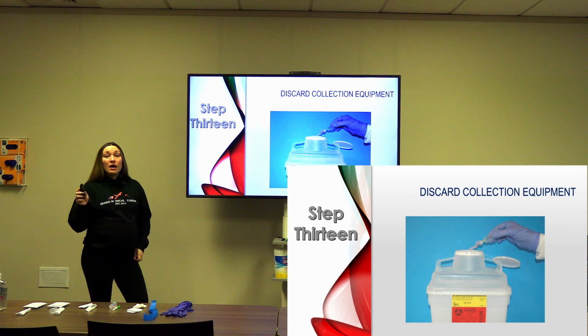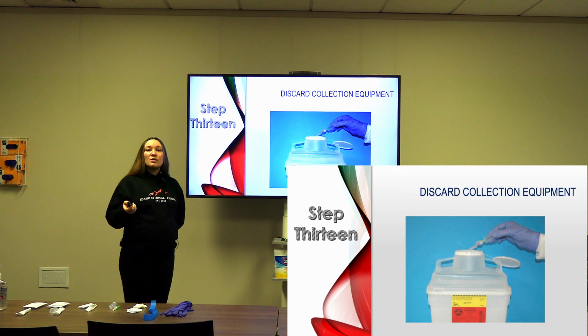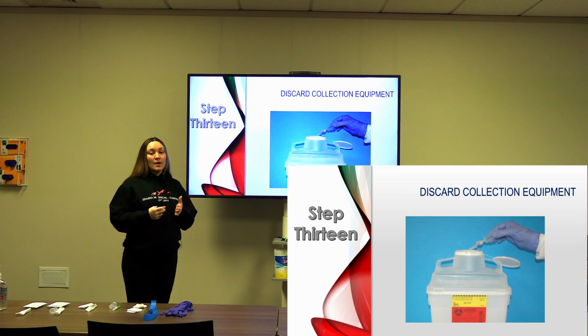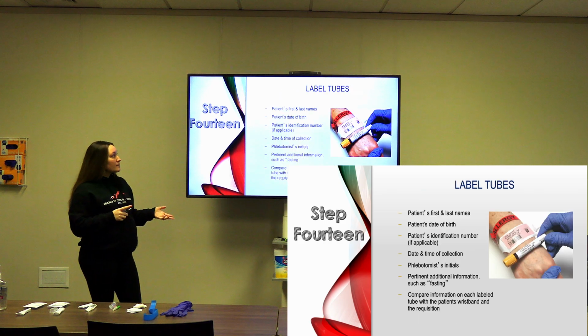As soon as the needle comes out, we are going to safety it. And if it's within reach, we're going to put it in the sharps container. If not, you can set it next to you on the counter or the bed or the chair. Just don't forget that you have to sharps it, okay? So discard your collection equipment.